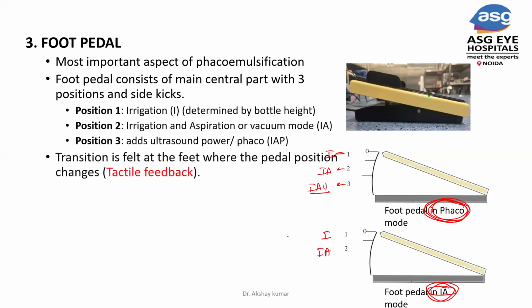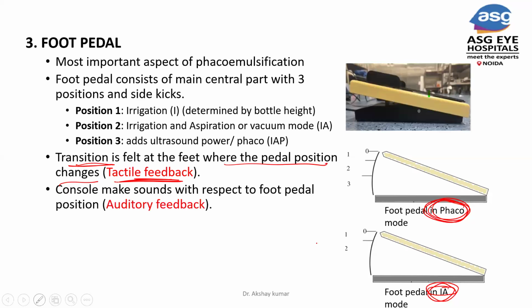Whenever you press the foot pedal, you will have a tactile feedback whenever you press it. Okay, where the pedal position changes, and with the change of the mode on the console, you will have a sound also, which is also called the auditory feedback.